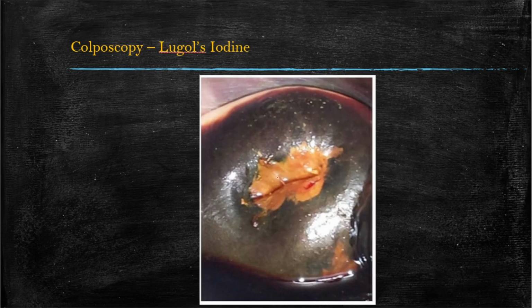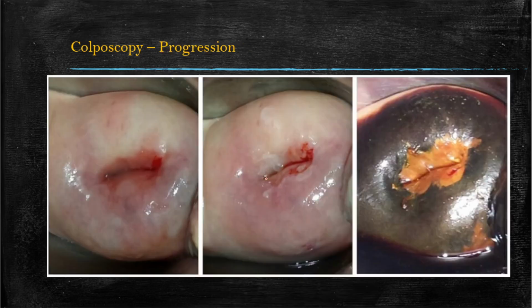Yeah, so you can see that this whole area doesn't have uptake, but this area right here that we outlined, and it looks like perhaps here there's a little bit of glare there. Sometimes you can just reposition the cervix or use a dry Q-tip to absorb any excess fluid or moisture there, and it'll help to really clarify that. But you can see the progression here from no solutions applied to the acetic acid, and we're starting to see, yeah, so this area here, which doesn't quite highlight as clearly as this one does at the 5 o'clock position.